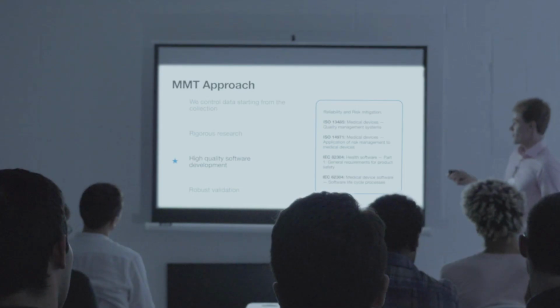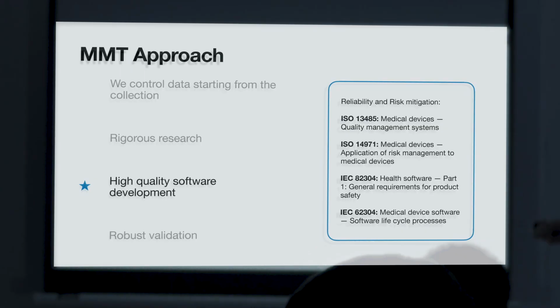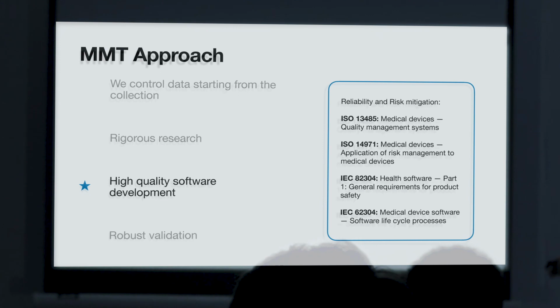So you need to analyze if this component fails, that there is no harm to the patient, or if there is no bug, it always works 100% of the time according to the exact specification you defined. And there are a set of standards we operate under. I'm not going to go through them, but these are quite extensive standards. In particular, 62304 is very important for medical devices, and we operate under all of these standards.